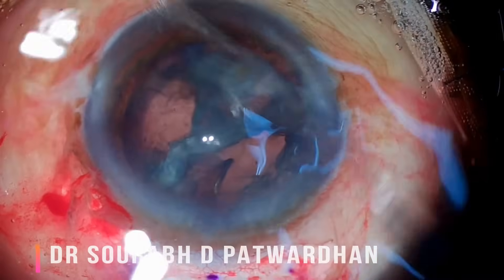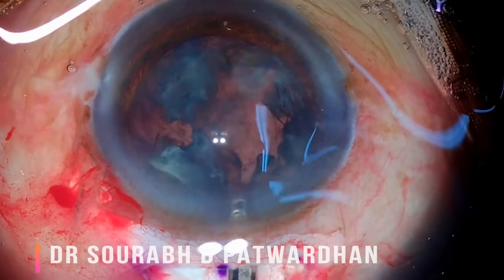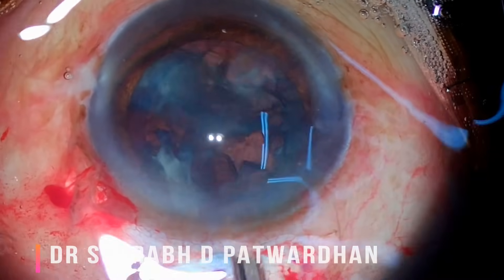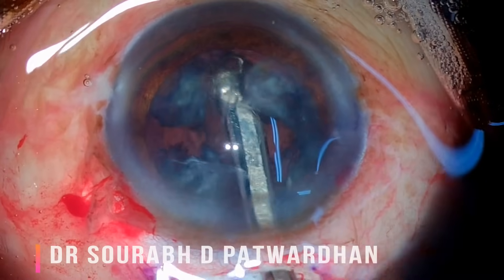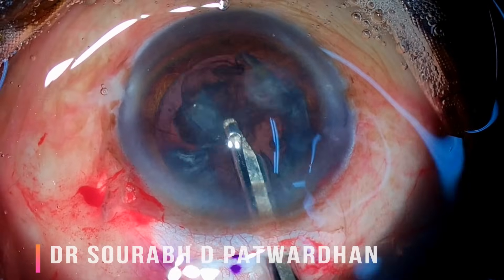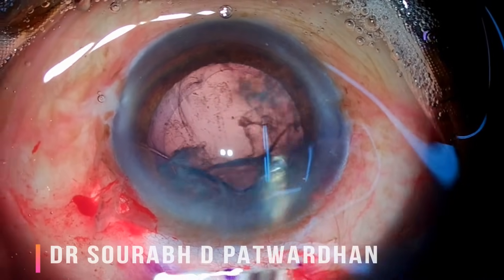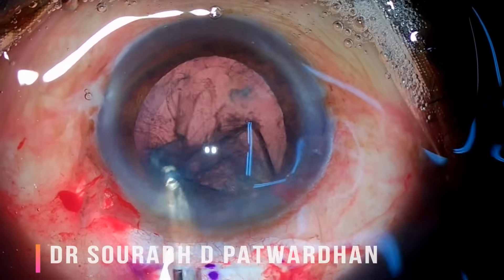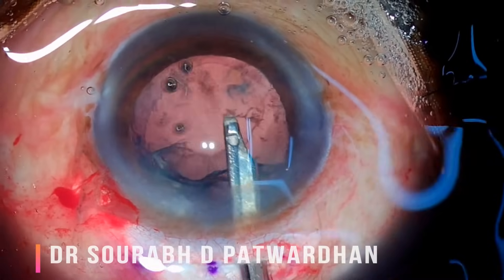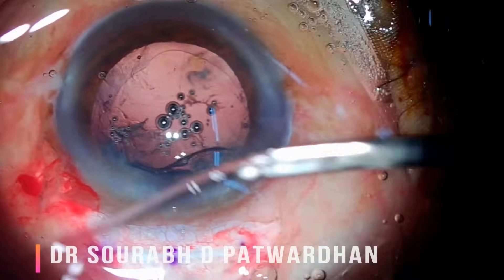Now the most important thing: using the Simcoe for irrigation aspiration. This is a manual cortex aspiration method — a low-flow method, unlike the coaxial aspiration we use with a PHACO machine. The principle is to catch hold of the anterior part of the cortex. The beauty of this instrument is that once occlusion is achieved, it does not get released unless you push fluid back, which you generally do not do. Once occlusion is achieved, you simply pull out the cortex. Do not try to aspirate the cortex inside the anterior chamber, which causes fluctuation and AC collapse.